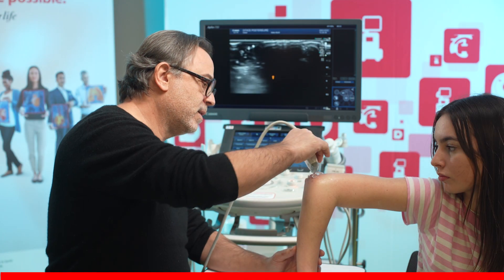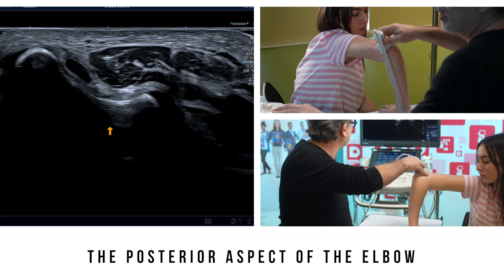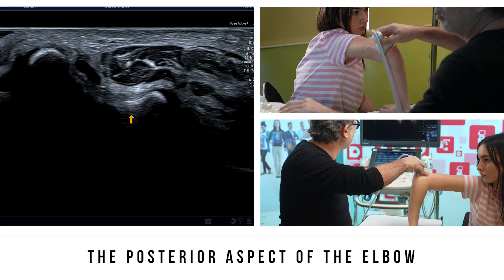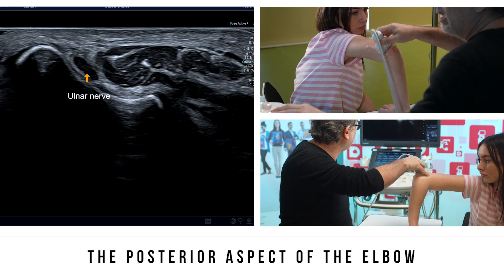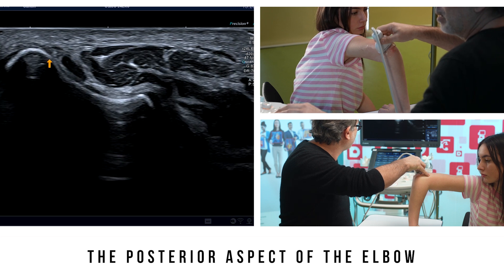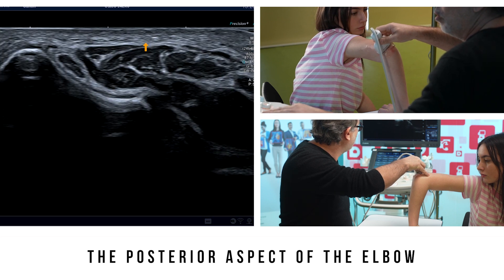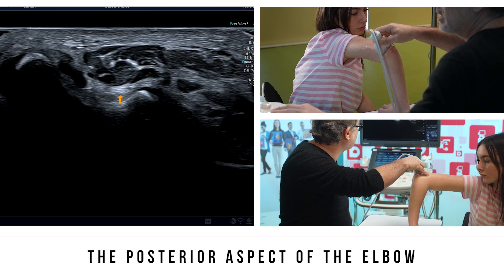The first image to generate is an axial section, which is somewhat general since it allows us to see all the structures that we will investigate later on: the ulnar nerve interposed between the medial epicondyle and the olecranon, the triceps, and deeper, the olecranon fossa.